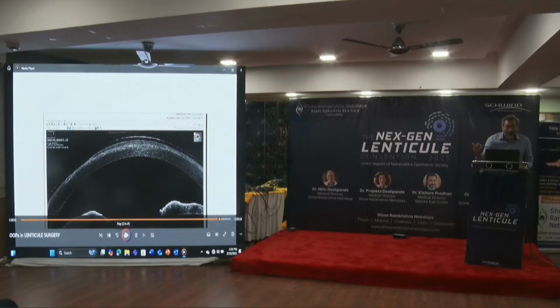She had hand movement vision. It was a blended vision kind of thing, one eye was for near, the other eye was for distance, and the distant eye, she had hand movement vision, and we were on and on and on. The whole cap started melting. And when the whole cap melted, she got 20/20 vision after that. She's absolutely fine. It took me one whole year for the cap to melt.